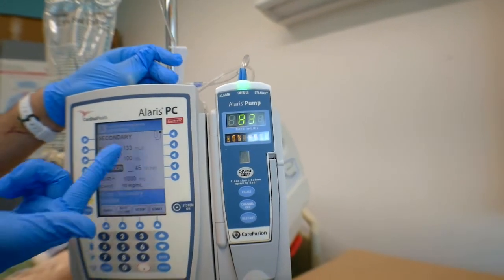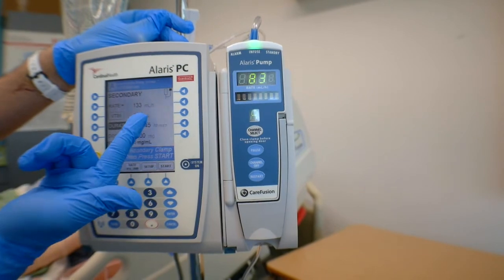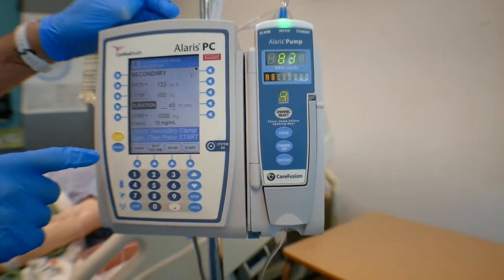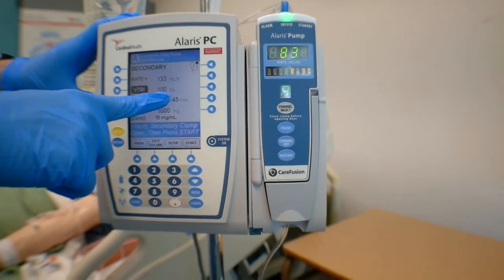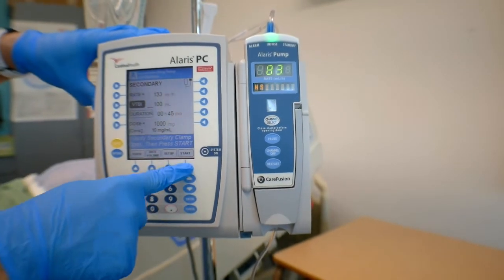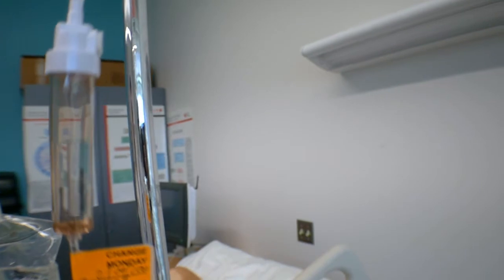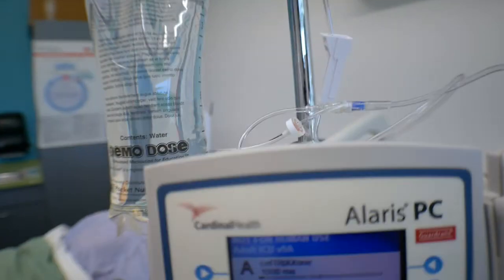All right. So since you've calculated your rate, just make sure the rate that you calculated reflects on the rate that the machine is telling you. So in this case, it's 133. So we already calculated that it's 133. So we verified that. So make sure that your volume to be infused is 100, since we want the whole 100 to infuse. So you verified that. Just press start. Okay. So you're gonna see, make sure that you see the chamber, that you see drops dripping. That's gonna be the sign that your infusion is actually going through.